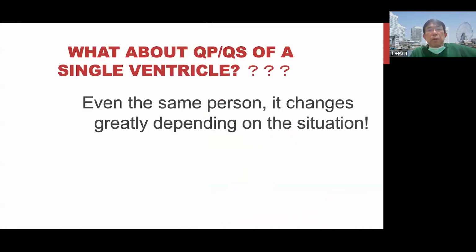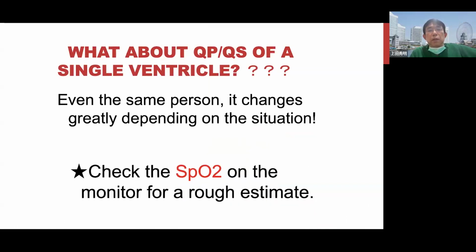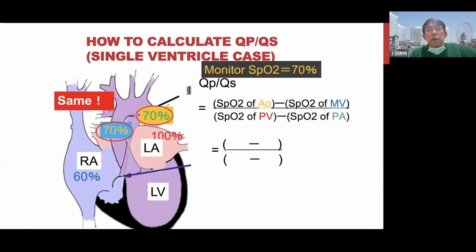So what about the QpQS of single ventricles? Even in the same person, it changes greatly depending on the saturation situation. So please check the SpO2 on the monitor for a rough estimate.